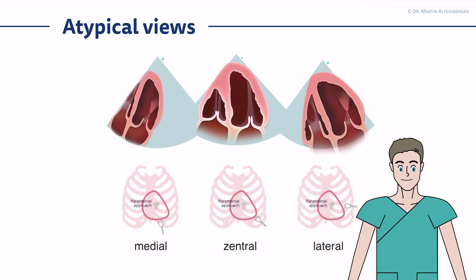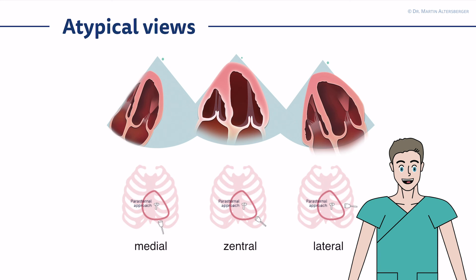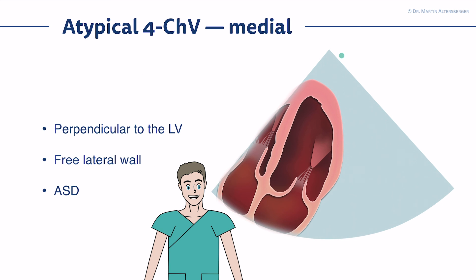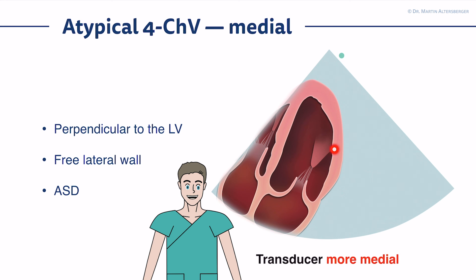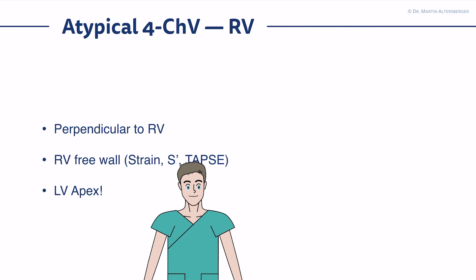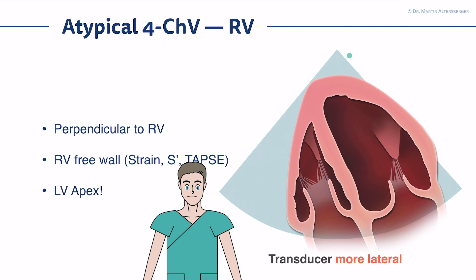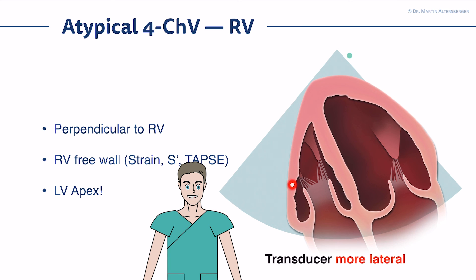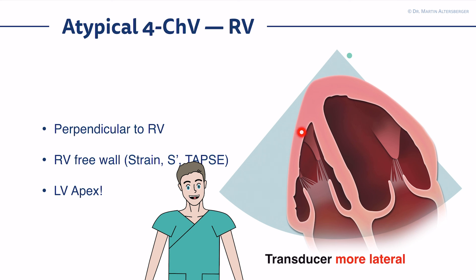You can move around and relocate the transducer and tilt to optimize your views and to get specific views for specific structures. In the medial view, you have to delineate the anterolateral wall. It is good for finding defects of the septum and atria because there is a little tilting involved, so you see jets probably better — and of course, for wall motion abnormalities. For the right ventricle, move laterally and you see the free wall, which makes measurements much easier.